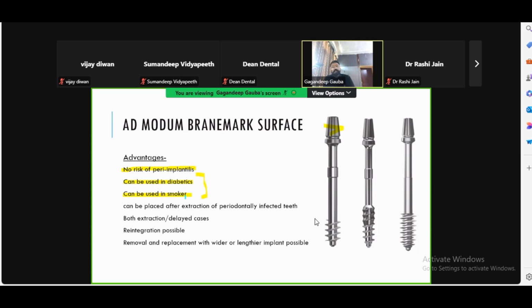In conventional implantology, when we want the osseointegration to happen, we have to wait. But in diabetics and smokers, the osseointegration still might not happen even after waiting for 6 months, and may lead to very painful failures for the patient also.